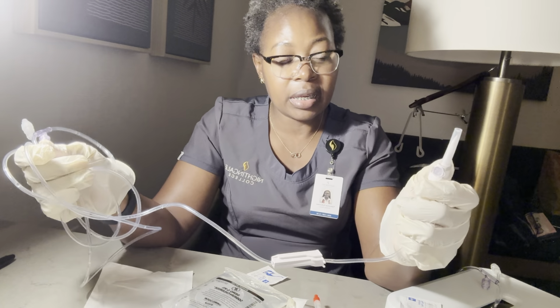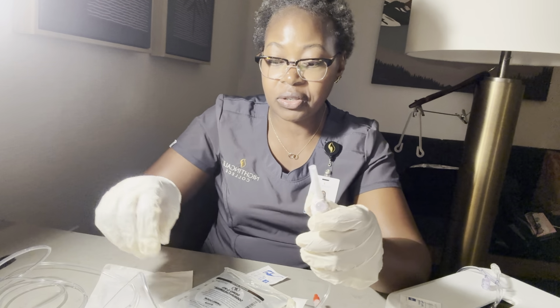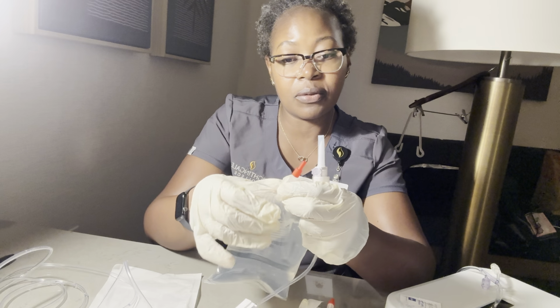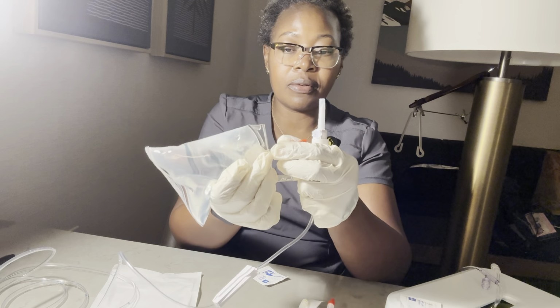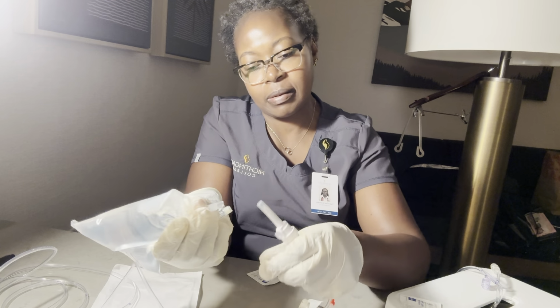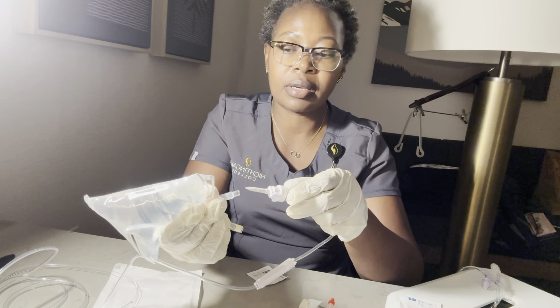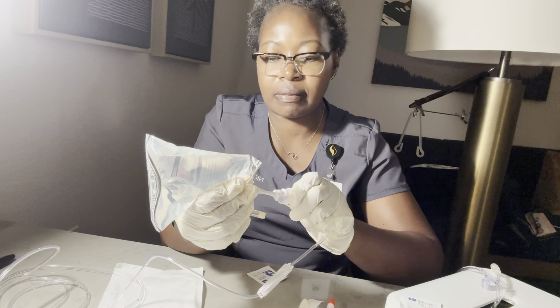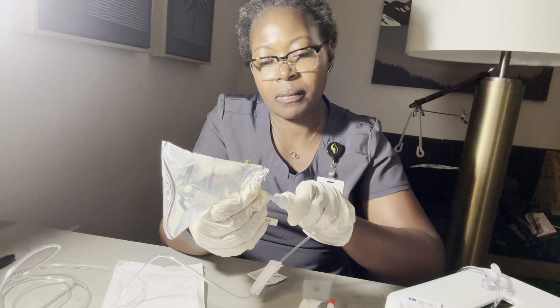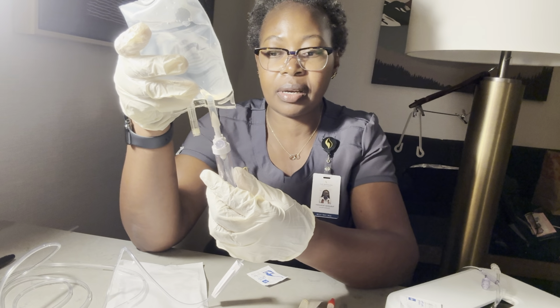And I will go ahead and prime my tubing. So I'll go ahead and remove the cover from the opened bag. I will fill the chamber.